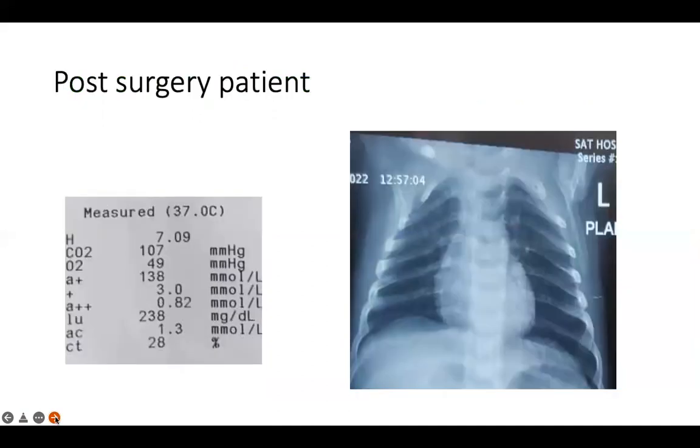You're okay with that. You have taken an X-ray. The X-ray is also normal. So whatever we discussed before is not there, right? Because graphs look okay, no block, and X-ray is also good. But what is it? Your pH is 7.09 with a PCO2 of 107. So why should a normal lung ventilation cause such a high PCO2?